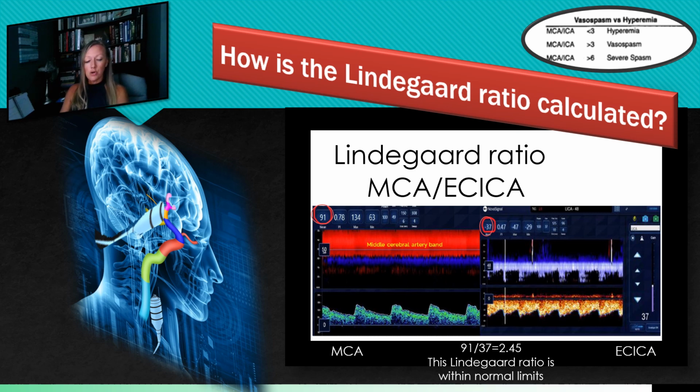The Lindegaard ratio is taking the middle cerebral artery, the highest mean velocity, and we are dividing it by the extracranial ICA to obtain a ratio. And our ratios usually indicate vasospasm beginning at a ratio of 3. And of course, the higher the ratio is, the more severe the vasospasm is.